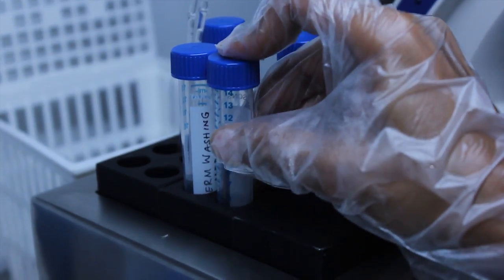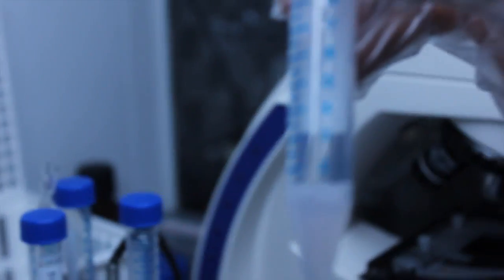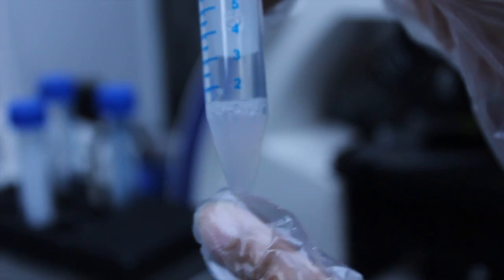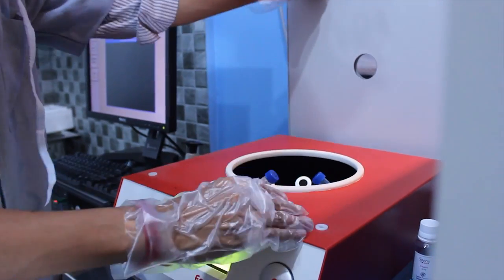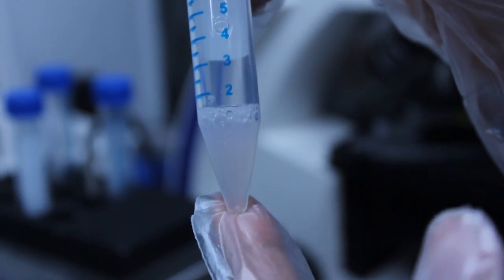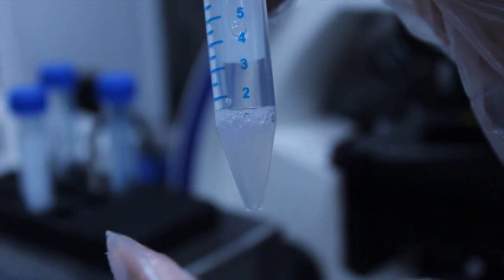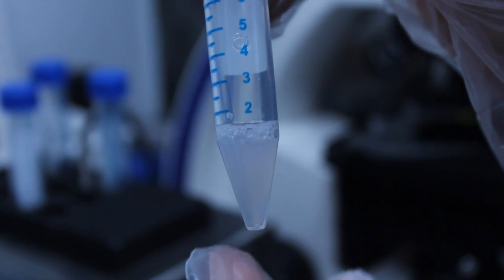This is a semen sample mixed with washing media. We will centrifuge this and collect the sperms as a pellet at the bottom of the tube. Then we can add the freezing media to it.